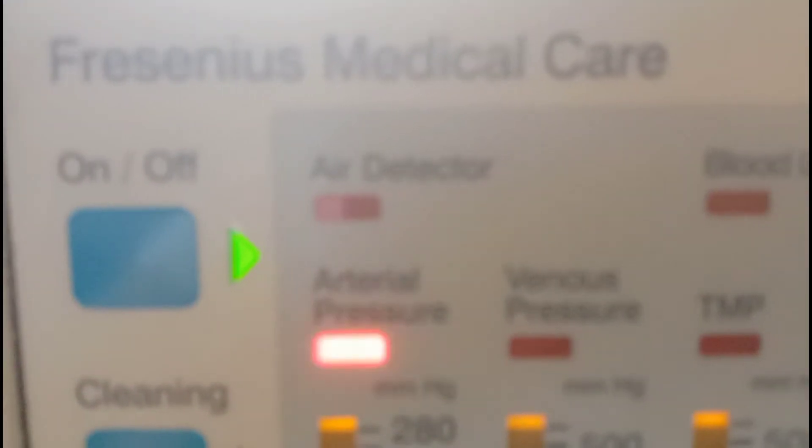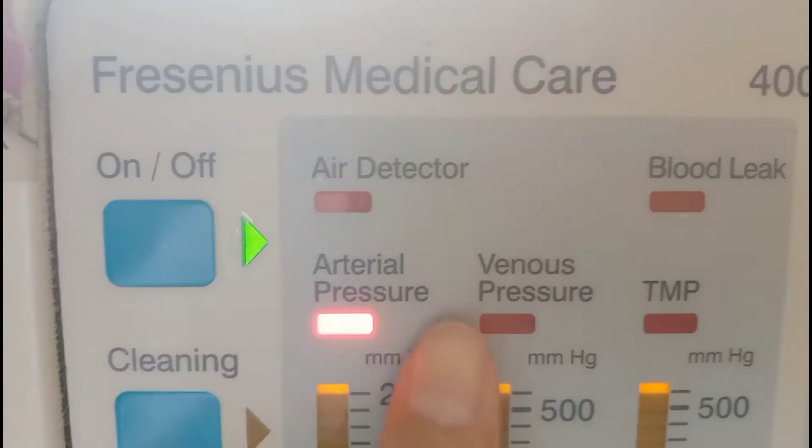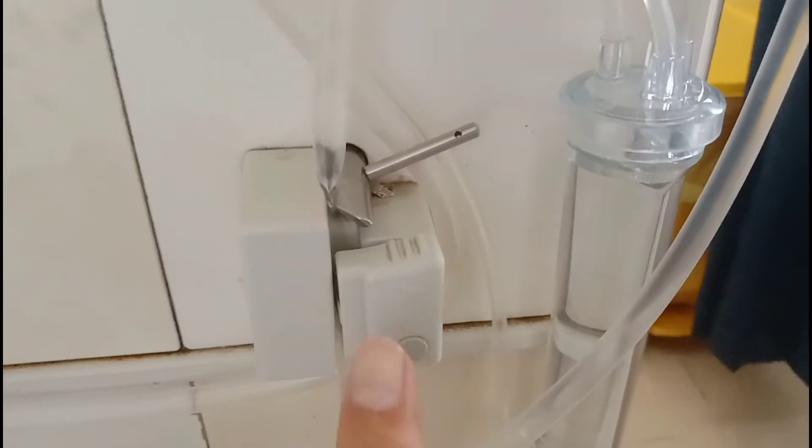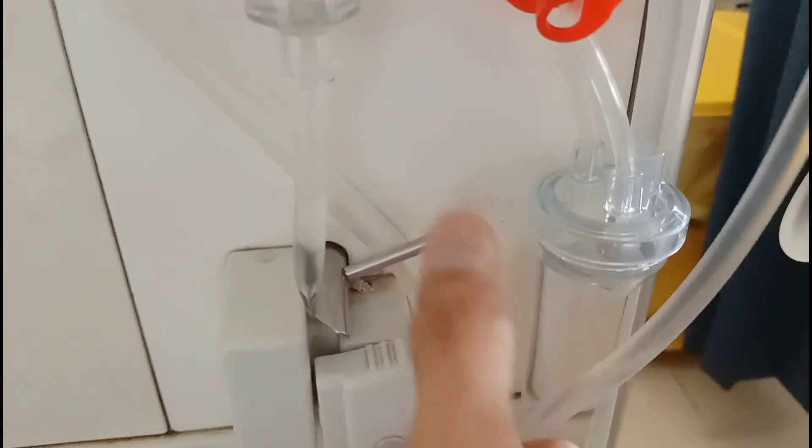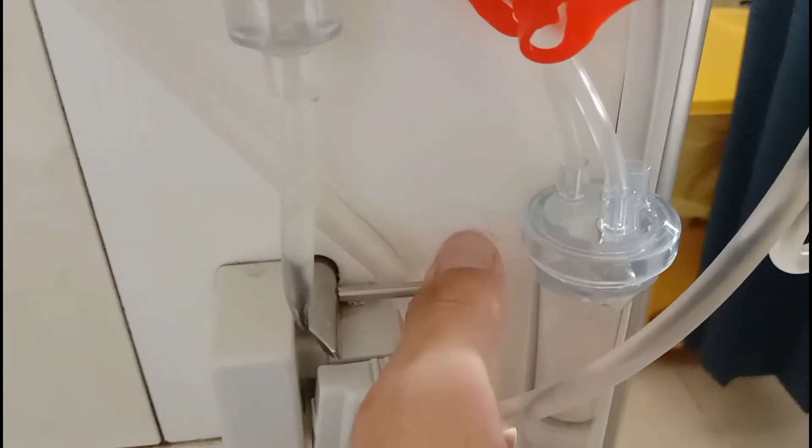Here you can see the air detector — the sign for air detector blinks when there is some air in the extracorporeal circuit, as shown on the screen. Here is the sensor from where air is detected. Any air in the extracorporeal circuit is detected by this sensor, which is an ultrasonic sensor, and the machine will shut off when there is some air in the extracorporeal circuit.